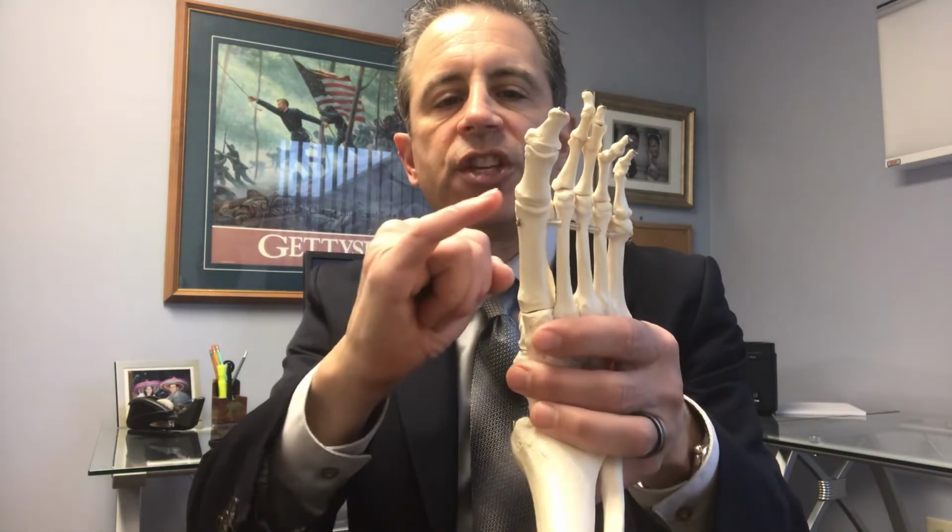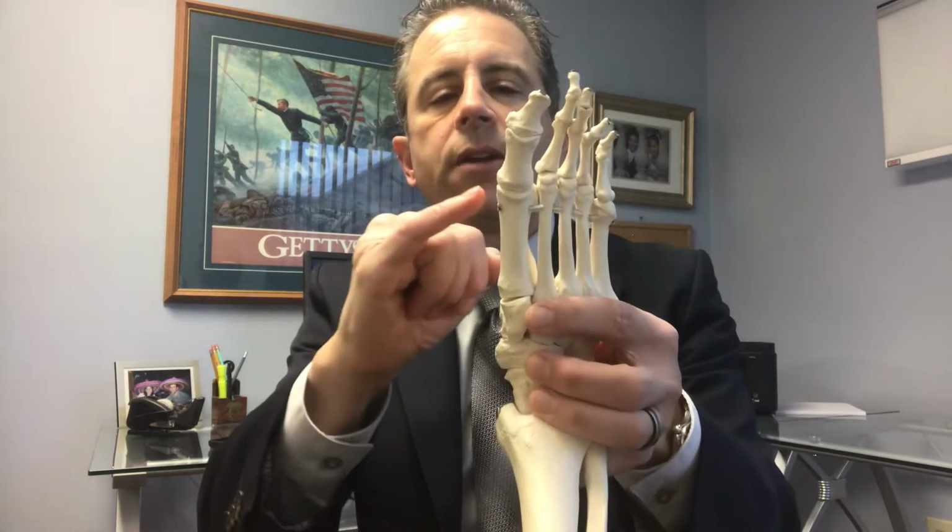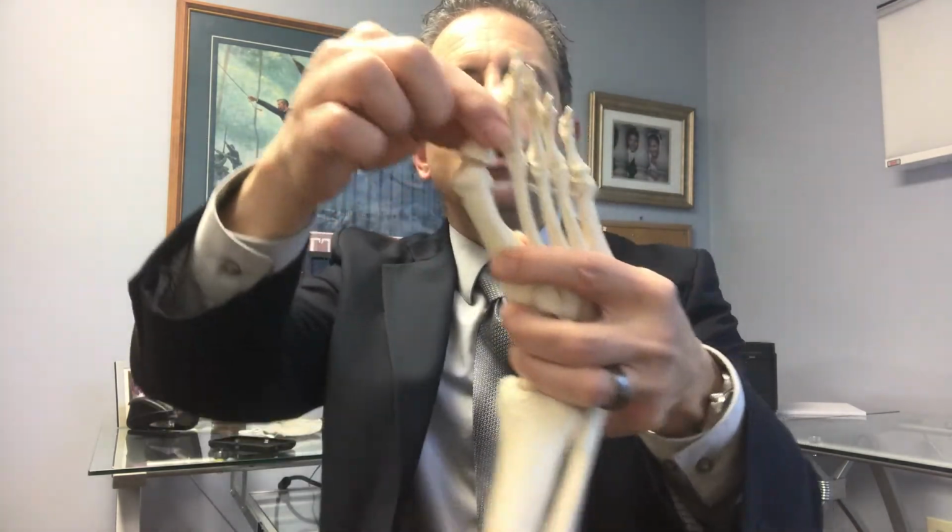All right, let's learn today how a custom molded, properly fitting and calibrated orthotic can prevent bunions from occurring or slow down their progression. They can't fix a bunion, right, because a bunion is bone, but it can slow it down, and it has the potential for preventing it from actually occurring. Now, to understand this, we need to look at the anatomy and understand what creates a bunion. So we're going to pay special attention to this first metatarsal. Here's the base, that's where the arch is, and here's the head, and that's where the bunion would be.